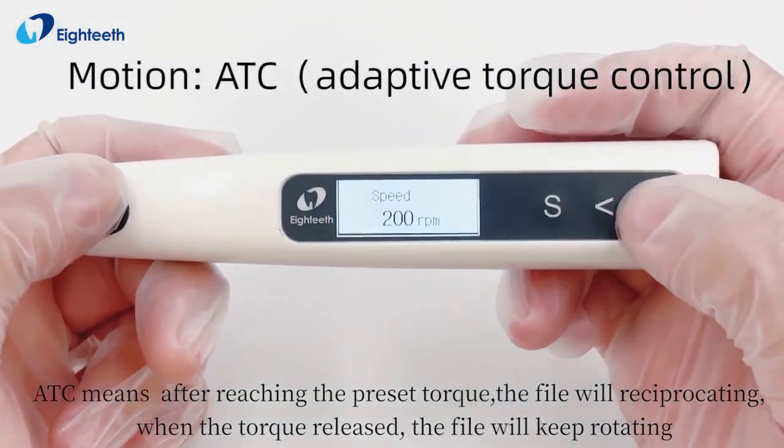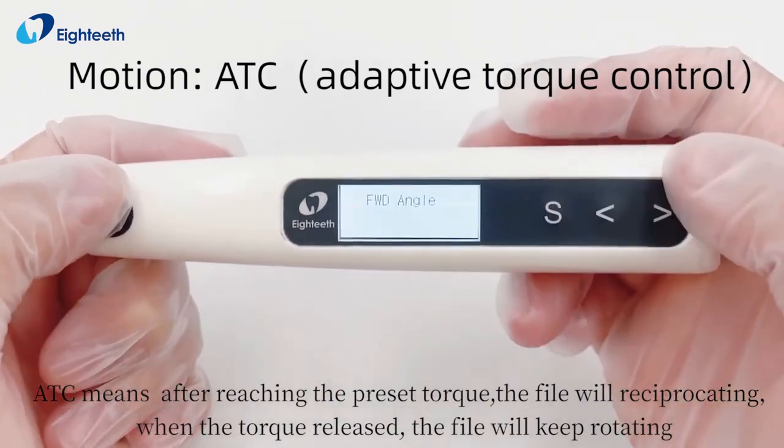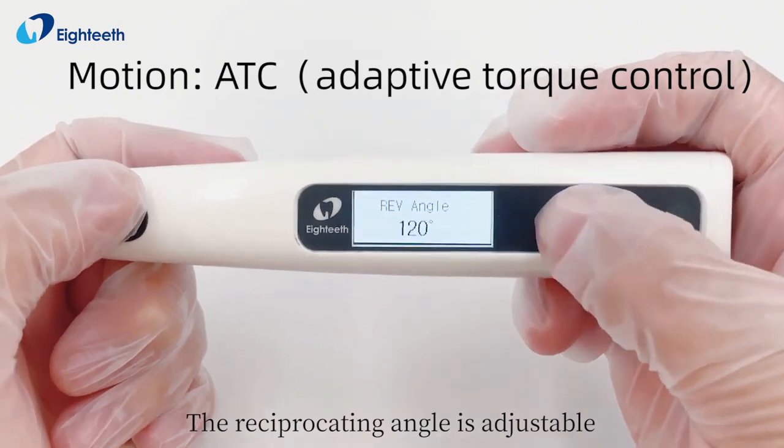ATC means after reaching the preset torque, the file will start reciprocating. When the torque is released, the file will keep rotating. The reciprocating angle is adjustable.